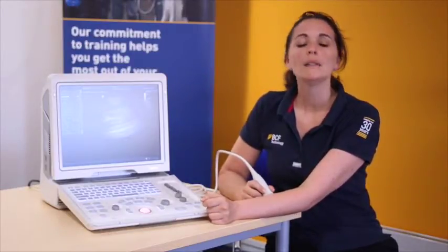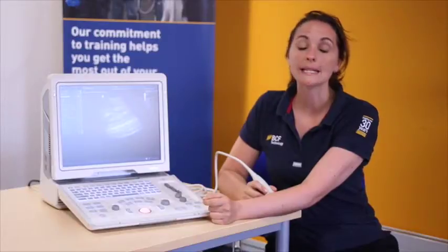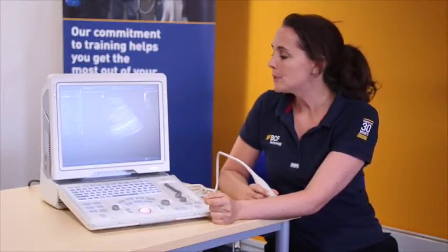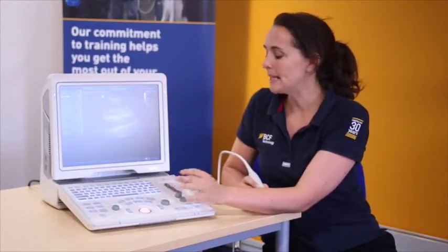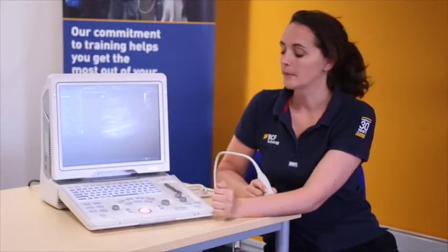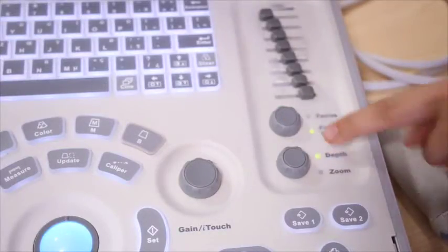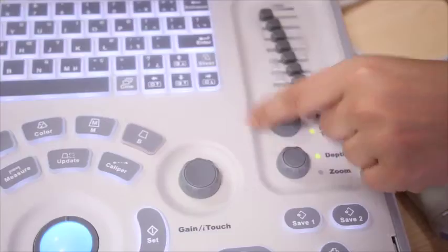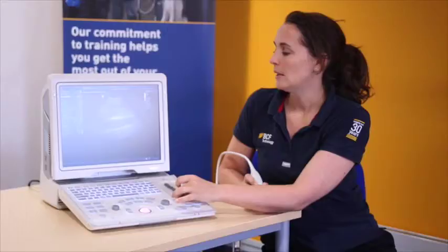Once I'm happy with my depth, I want to change the frequency. There's always a relationship between frequency and depth. The higher the frequency, the better the resolution and the better the picture you're going to get, but the less depth it can penetrate. As we're only scanning to about four centimetres depth here, I'm happy to increase the frequency. At the moment the green button is highlighting focus. To change this to frequency, I've just hit the button on top of the dial. Now that the green light highlights frequency, I can use the dial to increase and decrease the frequency.